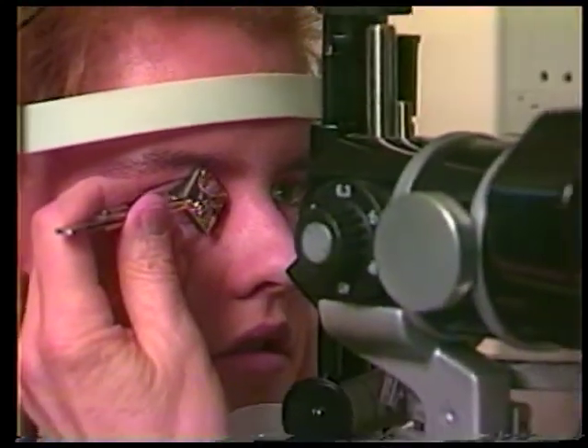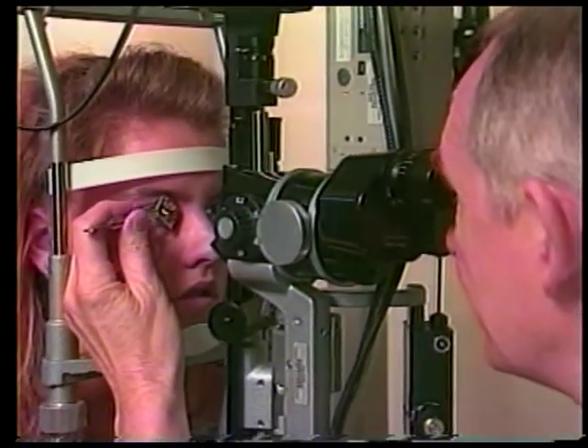To start, the light should be coaxially aligned with the microscope. Then, after focusing on the iris-cornea angle, vary the slit orientation and the slit-microscope angle to adequately examine the entire angle. In addition, the four-mirror lenses can be gently pushed onto the eye to see if the anterior chamber angle will deepen. This maneuver is very helpful in determining whether a closed appearing anterior chamber angle can be opened. Both eyes should be evaluated and compared. The usual problems with learning gonioscopy are keeping adequate contact between the lens and cornea, and creating folds that distort the view by pressing too hard.